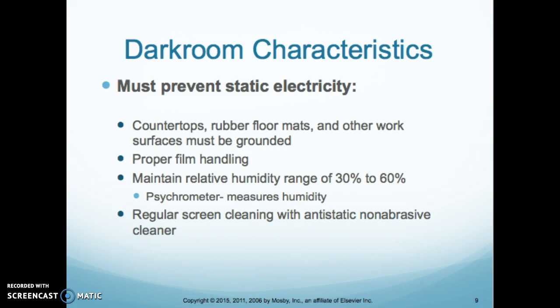Also, when you're pulling film out of the cassette, it sticks to the intensifying screen, and it'll cause static when you pull it out, so you have to be careful. You've got to move a little slower. We try to keep the humidity between 30 and 60%. Very important that you know those numbers right there. It's going to be on your test. And you need to clean the intensifying screens with anti-static cleaner.